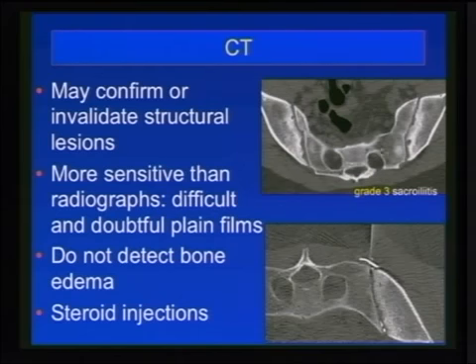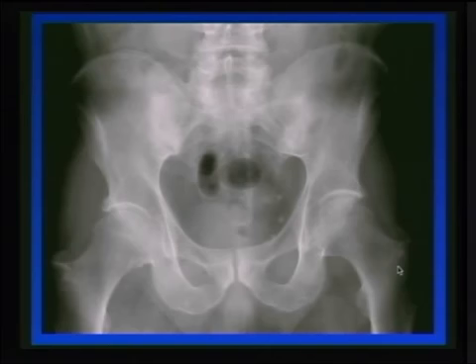If there is any fusion of this joint, it will be grade 4, and this is ankylosis. The CT scan can be used as well for guidance, for the diagnostic and therapeutic block. So it's very important to know the role of CT scan examination and the treatment of ankylosing spondylitis or spondyloarthritis.